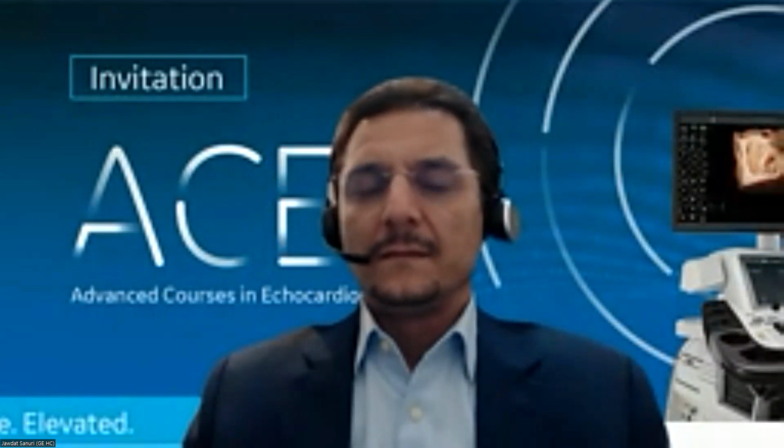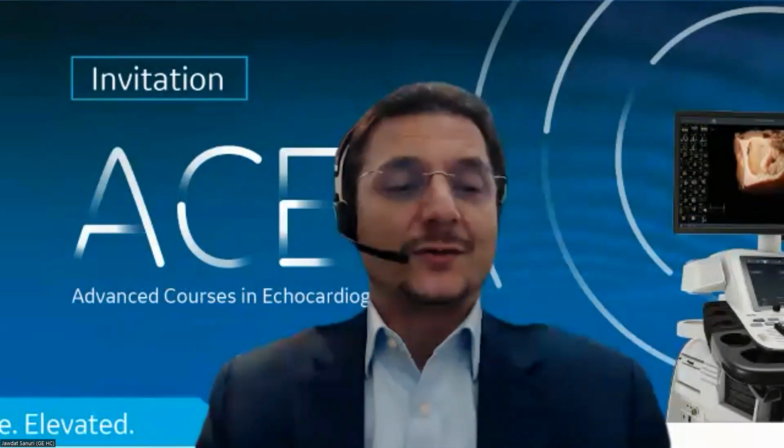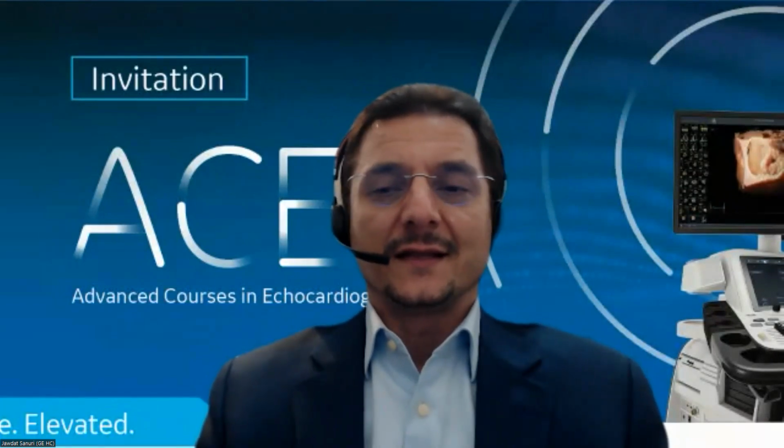So, Mr. Jawdat, the Achilles heel of all these measurements is the quality of image. If you don't have good image quality, you cannot trust the measurement. This is the problem with speckle tracking. Absolutely. Just like everything else in echo and in medical imaging in general, if it's not a good quality image, then nothing good can come of it. No good diagnosis can come out of it.